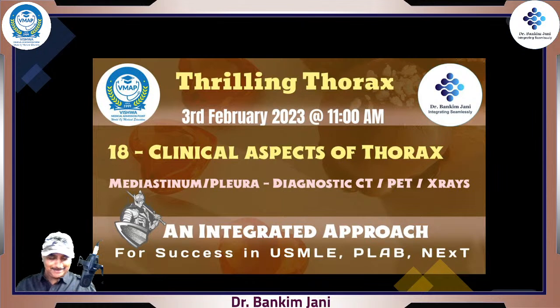So as promised, that's now the clinical aspects of thorax. And today we'll be talking about mediastinum and pleura, right? So that we'll see the diagnostic X-rays, CT, PET scan, and the 3D reconstruction and much more. So let's start.